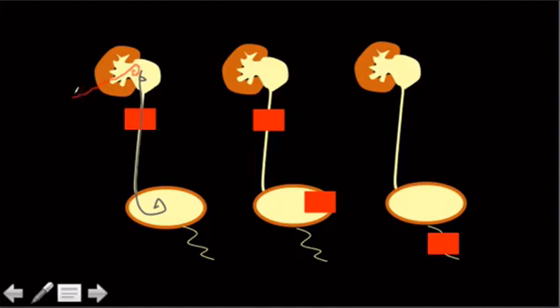Some newer literature is suggesting maybe you don't even need that, but when I trained, everybody pretty much did that. And then once it's working, you can pull it out. But the ideal scenario would be to internalize the drainage to get past that obstruction.